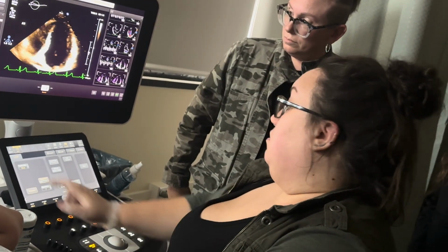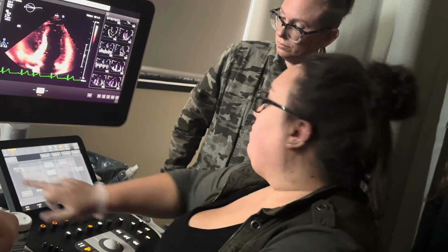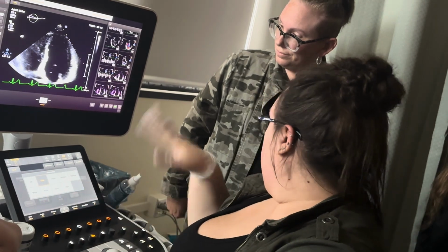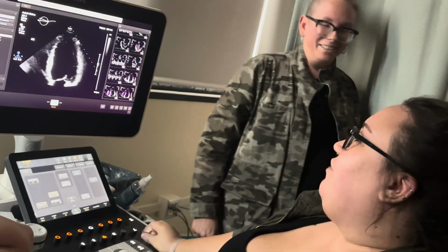It does look a lot more clear. Right? The colors. Yep. And it's all preference. You can use whichever one. I don't like the slate. I've never liked slate because I feel like it's just very, I don't know. You and I are opposite. I know. It's funny. All right.